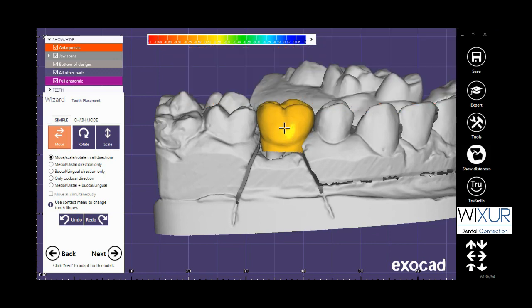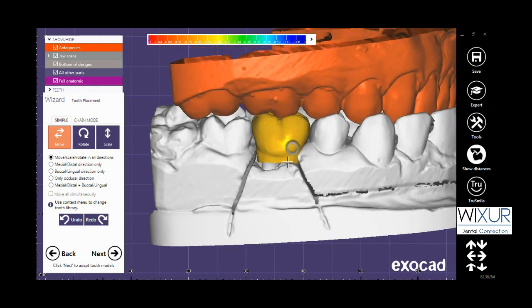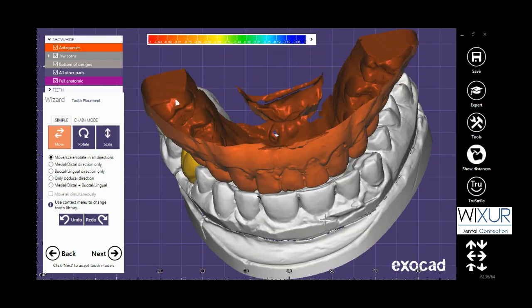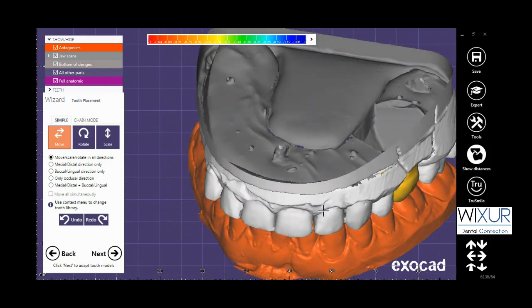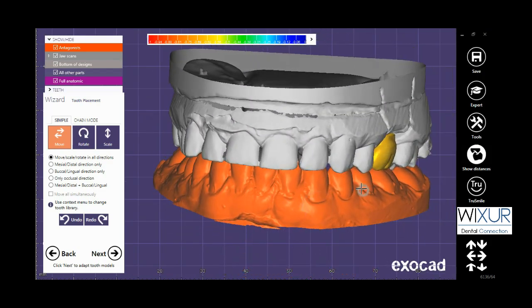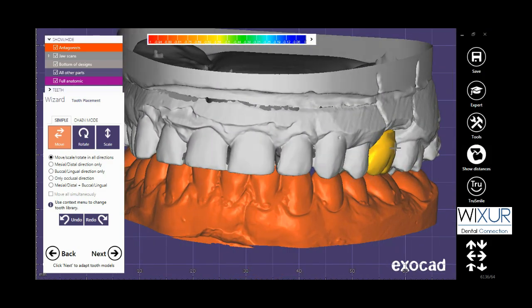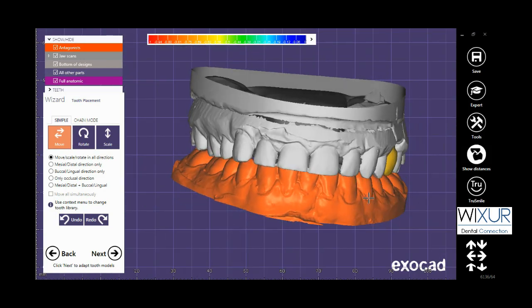Press or hold the Alt key on the keyboard to bring the antagonist and check the relation. It is also possible to hold Alt for the antagonist and hold Ctrl for rotating the crown at the same time, like I do here.